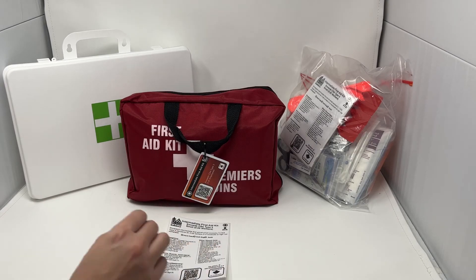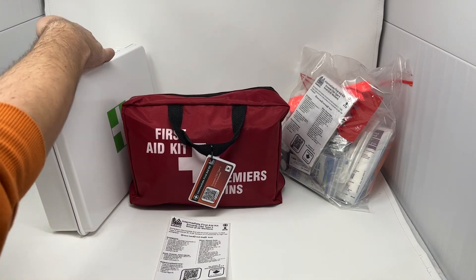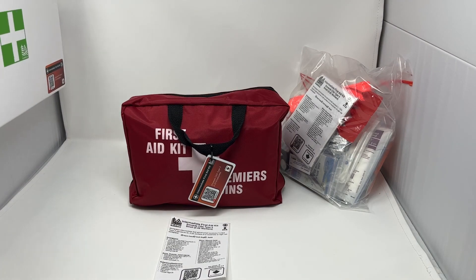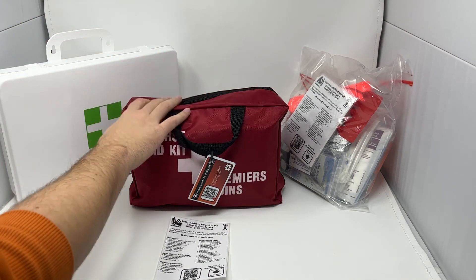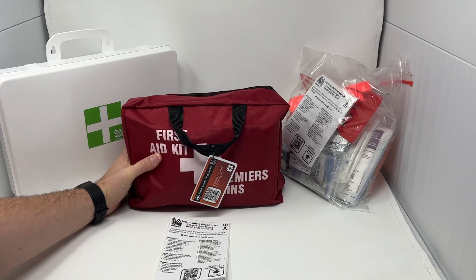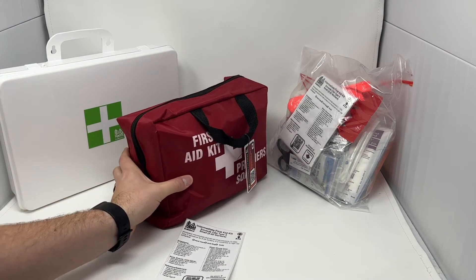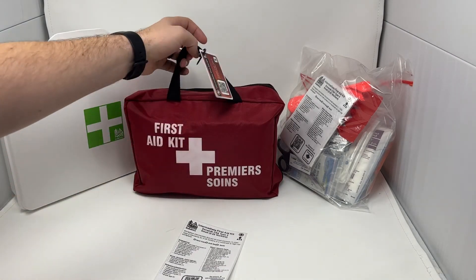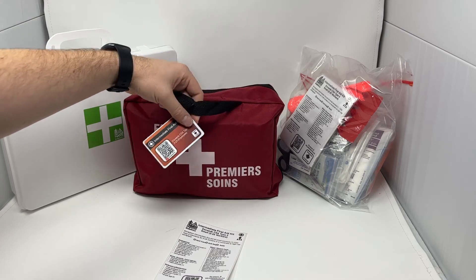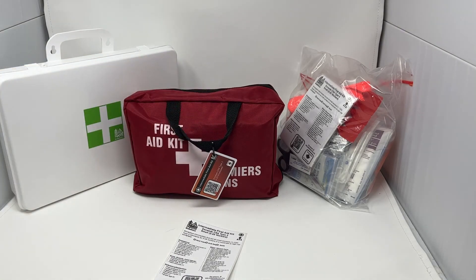We have three options for this kit. We have a hard waterproof case that's wall mountable — there are two screw points where you can mount this to a wall. We have the soft case, which is good for traveling around, good for vehicles, good for where you need to consistently move workers around such as a camp. The soft case is high visibility red with bilingual First Aid markings, as well as our card on the front to signify the kit type.